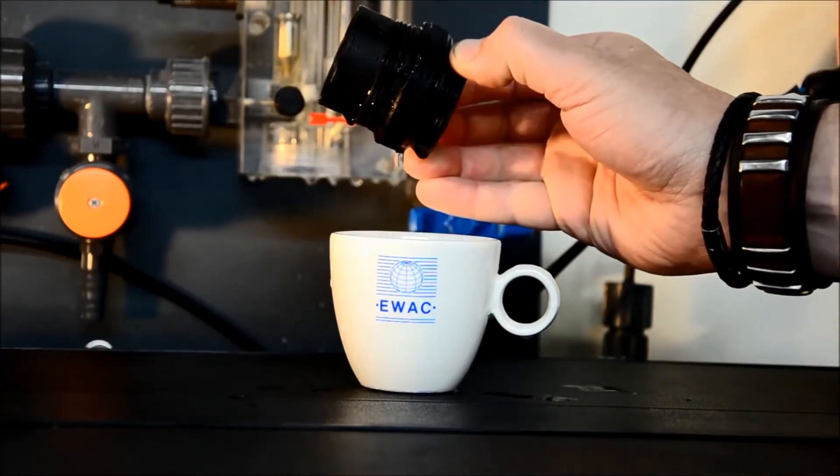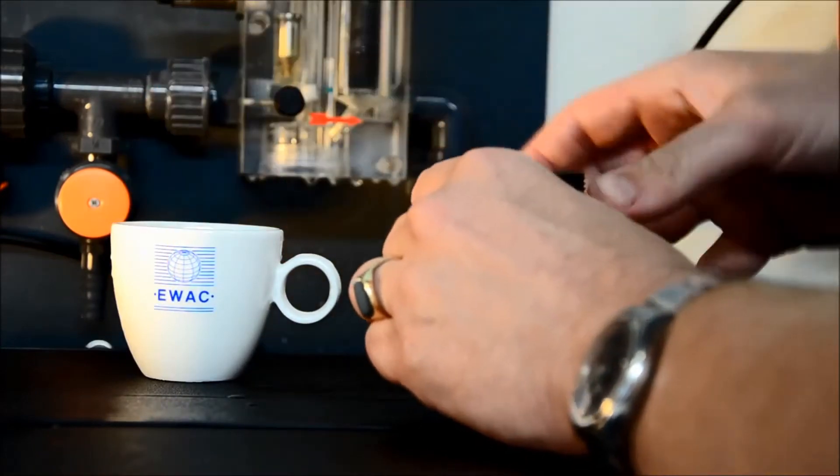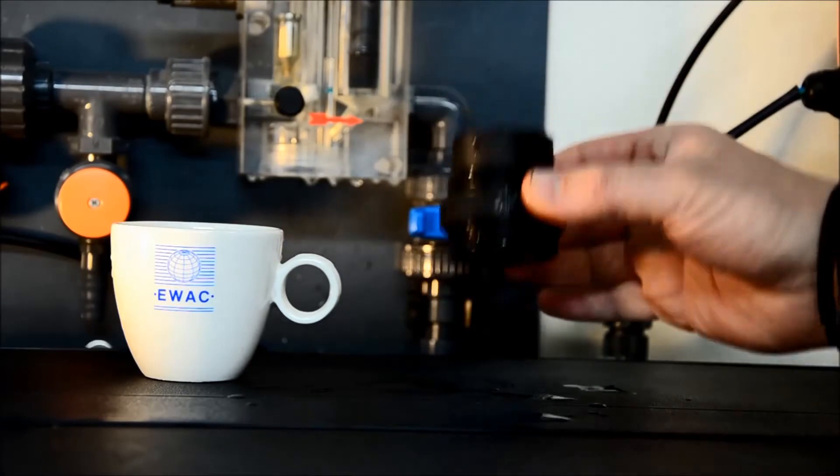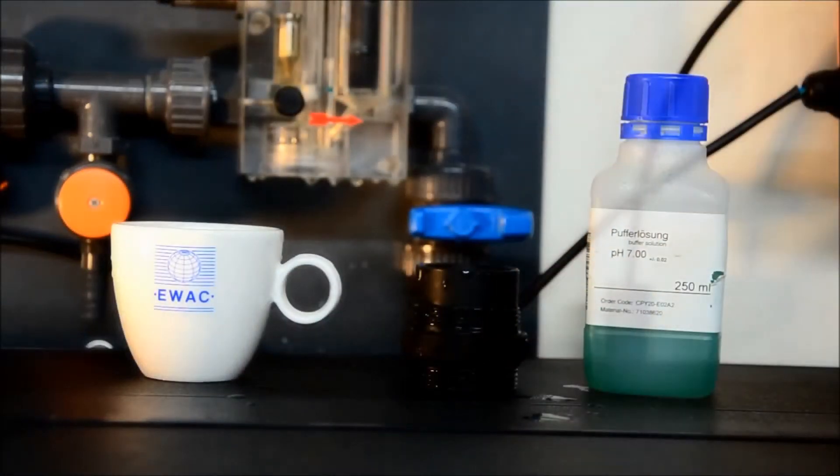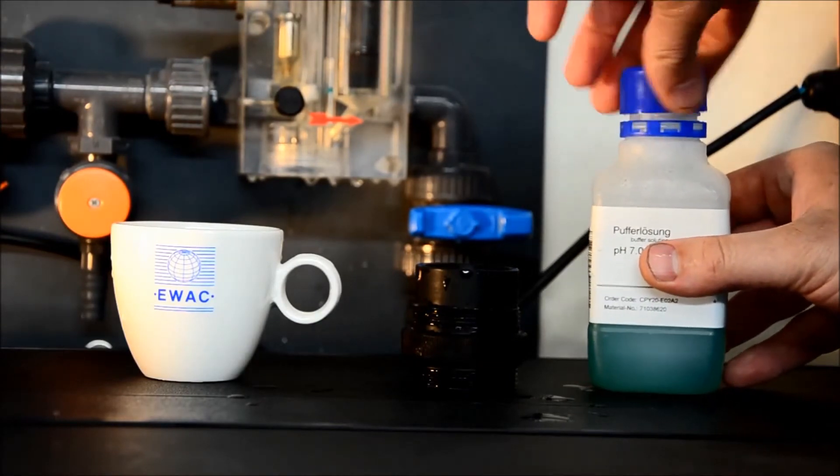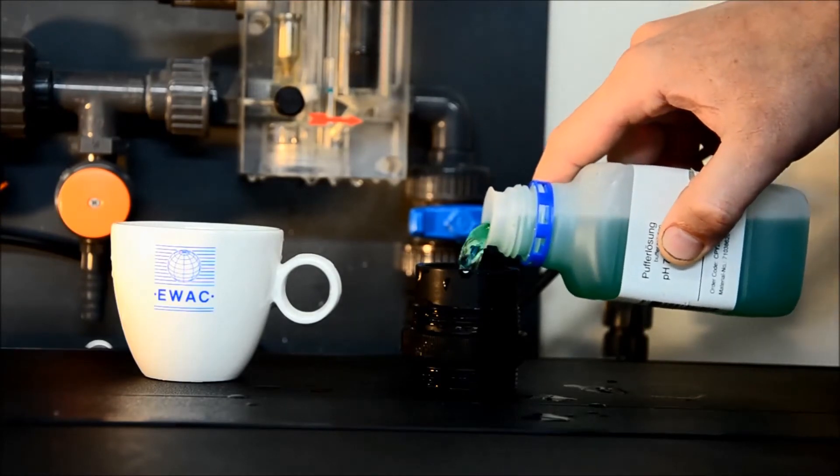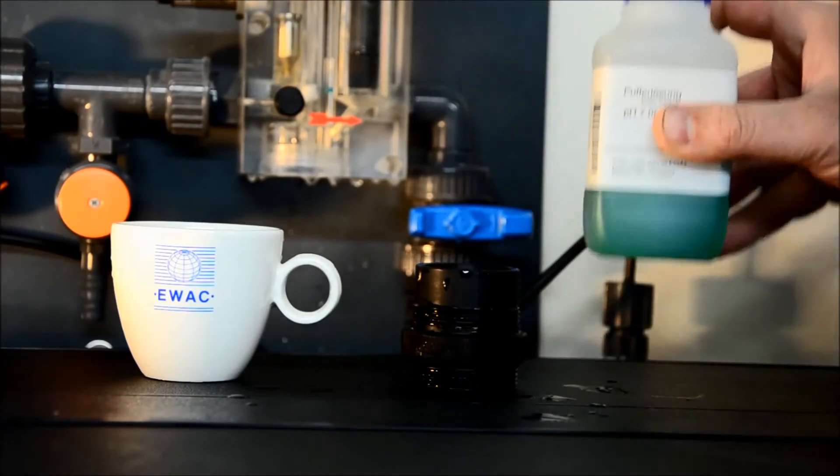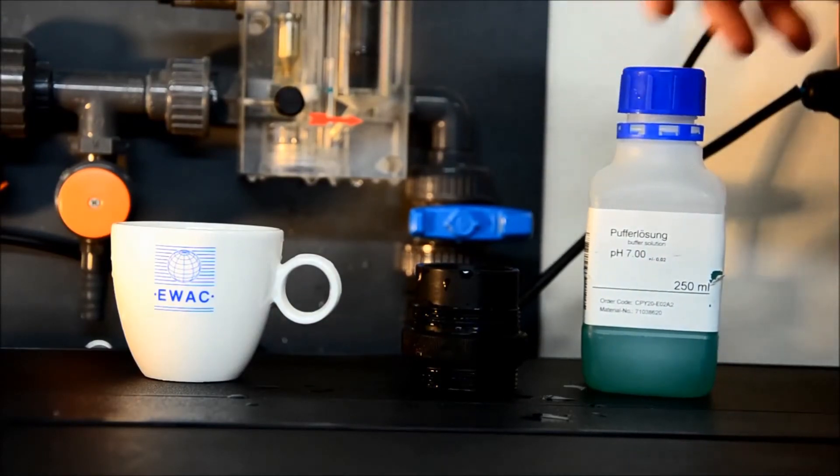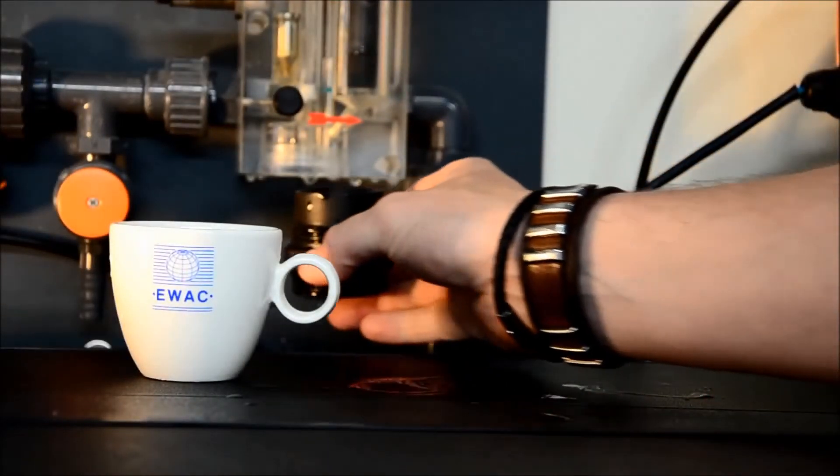Empty the cap completely. Now notice that the cap has two different sides - one is deep and one is shallow. Turn the cap with the deep end facing upwards. Take the bottle of pH 7 buffer fluid and take off the lid. Then fill the deep end of the cap up to about 5 mm below the rim. Then pick up the cap and screw it back into the measurement cell.